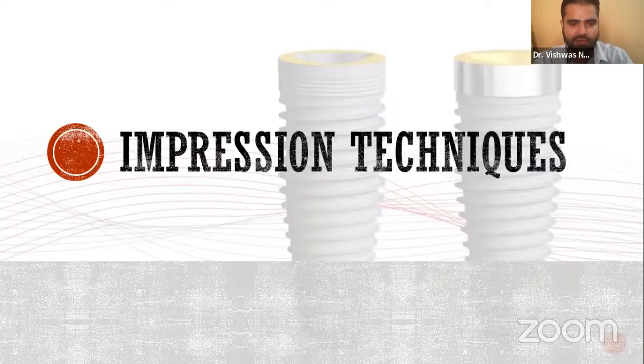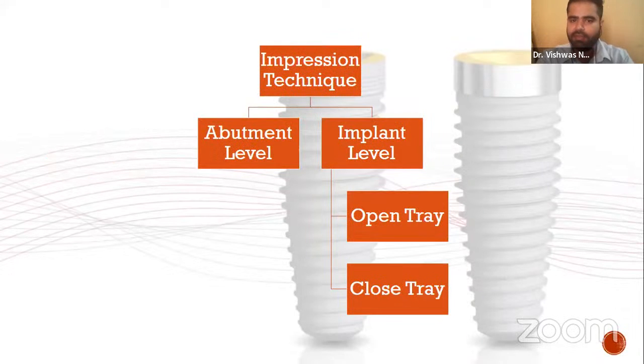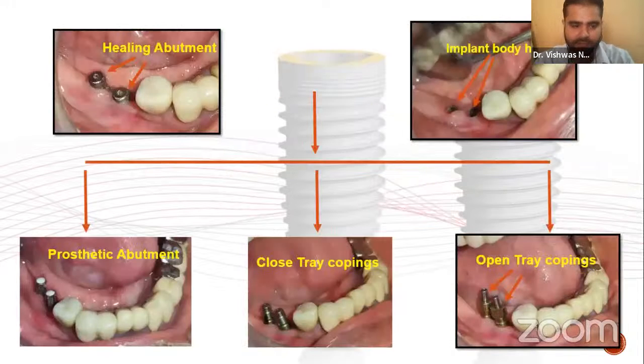So now we'll be discussing various impression techniques. They can be either abutment level or implant level. The implant level impression can further be divided based on the copings, as you may already know, into open tray and closed tray. A patient normally requires prosthetic care after the second stage of the implant surgery. The most common finding you will be observing after the second stage is a healing abutment placed onto the implant head. So the first step that we do is we remove these healing abutments and we expose the implant head.